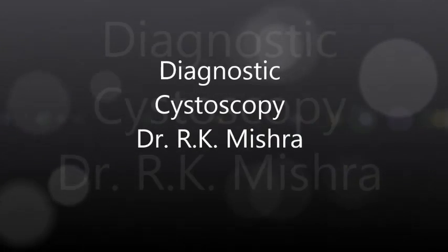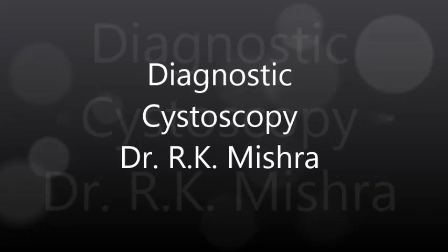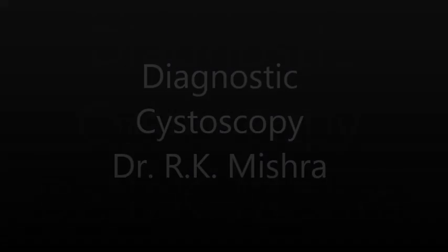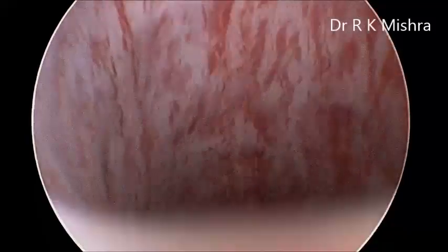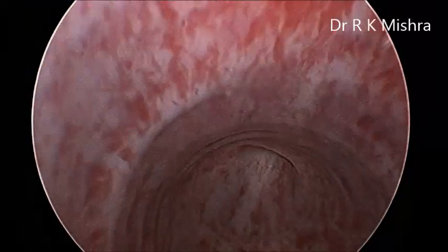This is a case of simple diagnostic cystoscopy in the male patient. The male urethra is S-shaped. You should enter always under vision — initially the black hole has to be seen, and then you have to turn it up.